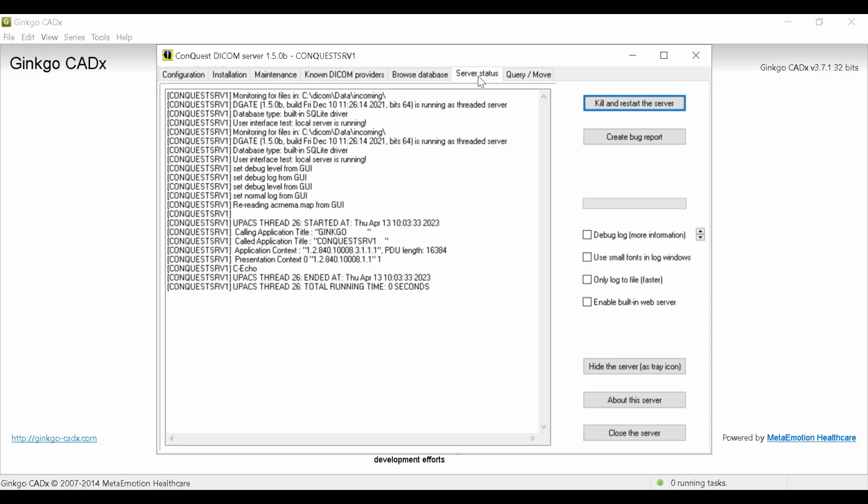Look at what it says here. Ginkgo talked to ConQuest. It used this format for sending the data. It said C echo. C echo is a DICOM command. It's sometimes called a DICOM ping. It's a handshake. It actually goes a little further than ping. Ping is a great handshake. It says, hey, send me this packet back. Do it 4 times. Great.